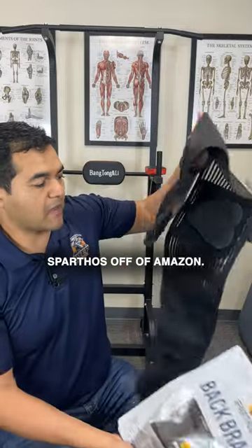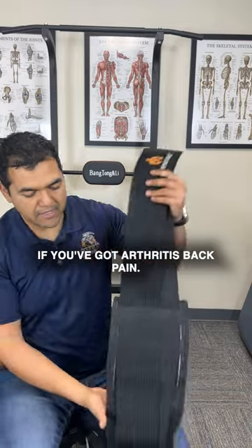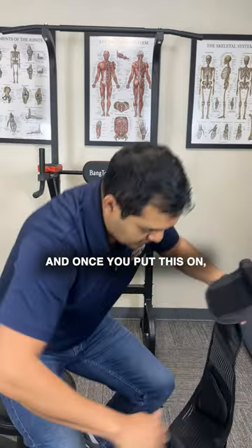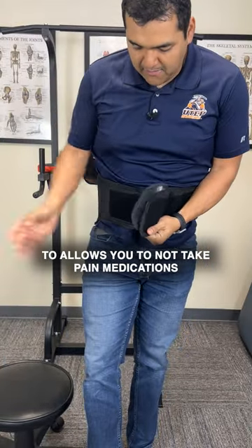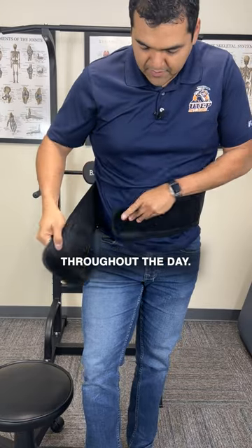I got this back brace from Sparthos off of Amazon. This will give you some quick relief if you've got arthritis back pain. It's got a double strap system, and once you put this on, it can support your spine to allow you to not take pain medications and get you some more movement throughout the day.